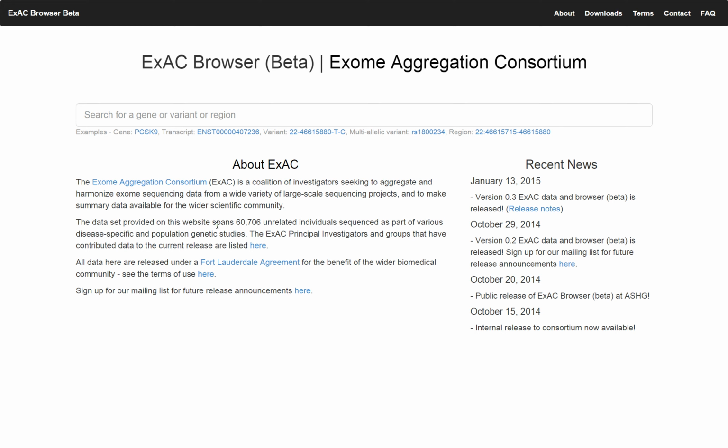I'm going to be reviewing the Broad Institute's ExAC browser and other methods of looking at variant frequency in the general population. I'll start with ExAC because it's the most comprehensive way to look at population data for particular variants and has a very user-friendly way of doing so.